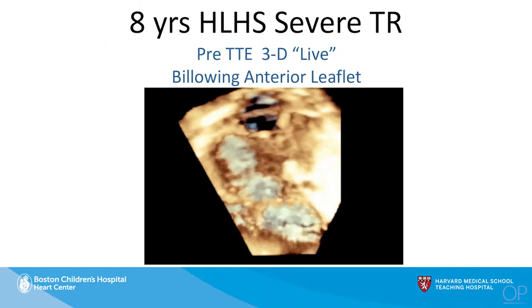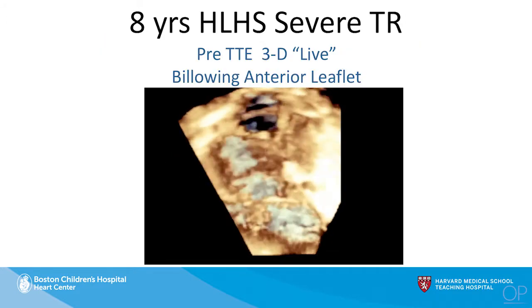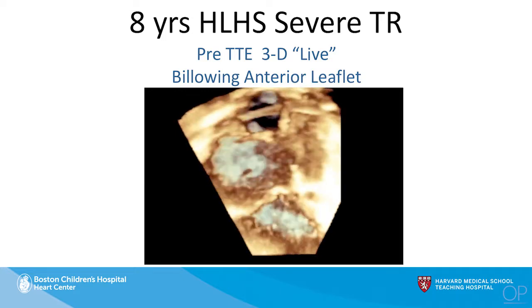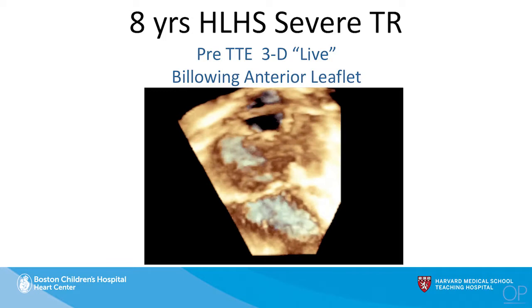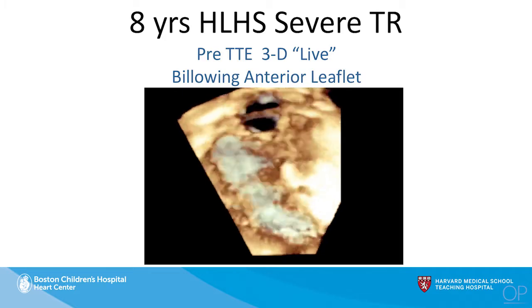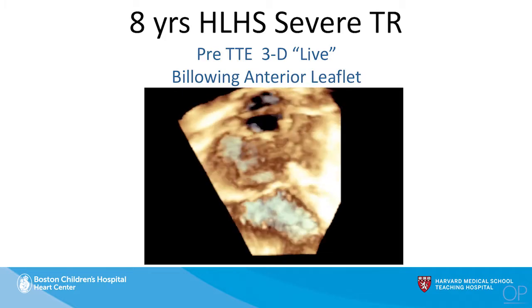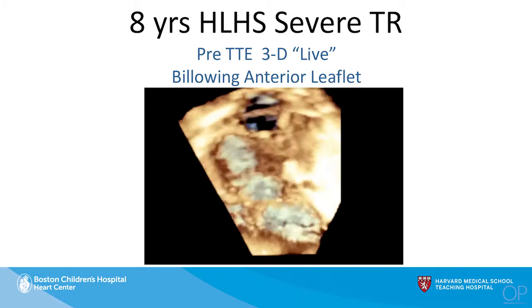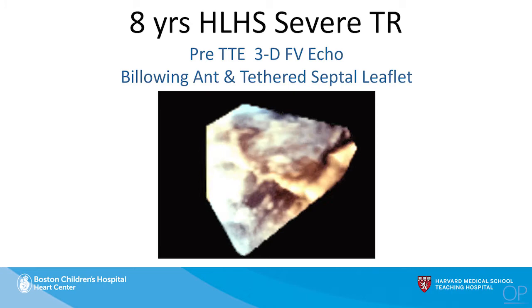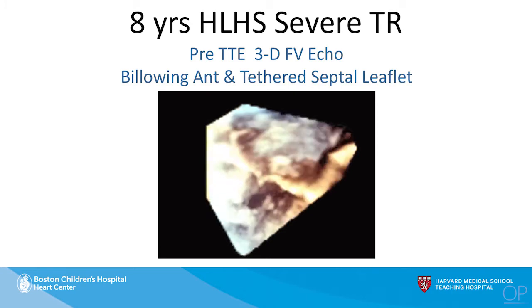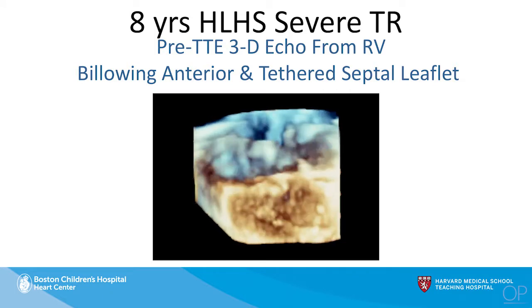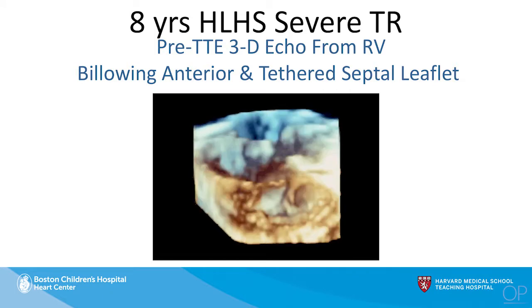In this patient who was in the ICU, we went up to image him with 3D echo. This is just a live 3D image — we just put the transducer down — and what was most notable, because we can see in three-dimensional perspective, was that this leaflet is not just prolapsing. It's actually scalloping, perhaps billowing, or perhaps even flail. We did a 3D volume data set, and by just changing the imaging plane, you could see the very significant scallop of that leaflet.